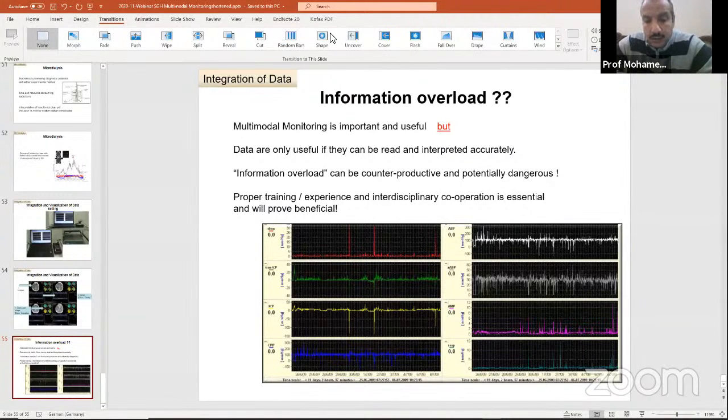So again, the ICP readings will be more valuable for me than the saturation or the PO2. The second issue is the world is now going to less invasive techniques. And of course, we have many non-invasive techniques to detect the ICP, especially for patients under sedation or comatose patients. The idea of measuring the ICP for those patients is to detect deterioration before the clinical deterioration. If I'm following a patient with conscious level assessment every minute or every hour, the deterioration happens a while after the increased ICP. So I need to make an intervention before the conscious level becomes worse. This is the idea of monitoring.